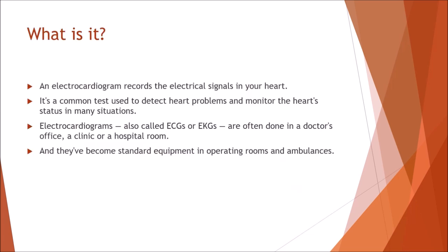Right, so we have to start off with what is the electrocardiogram? Let's break that down. Electro, meaning electricity. Cardio, meaning heart. And gram, meaning, in this case, recording. So the word itself literally means a recording of the electrical activity of the heart.